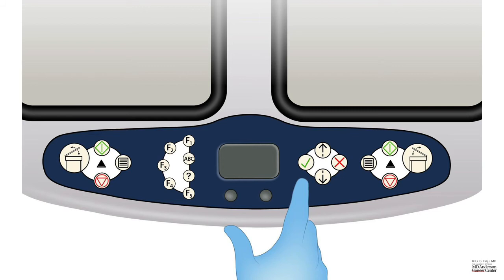At this point, I would like to talk about an important concept called contact time. The amount of time the high-level disinfection solution will be in contact with the endoscope, both inside the channels and outside the scope, completely contacting the entire scope.